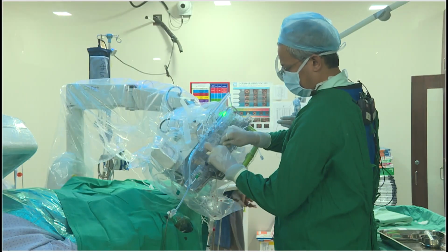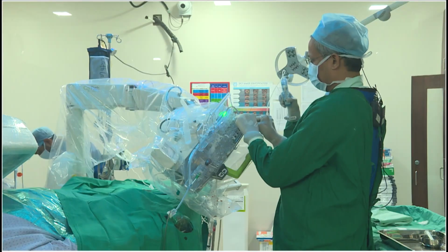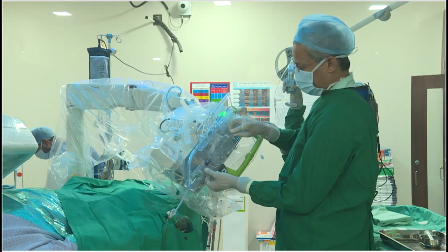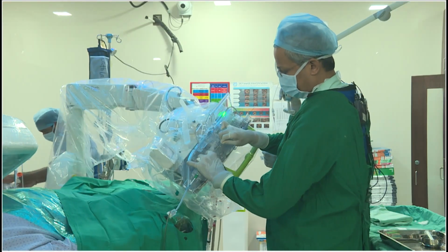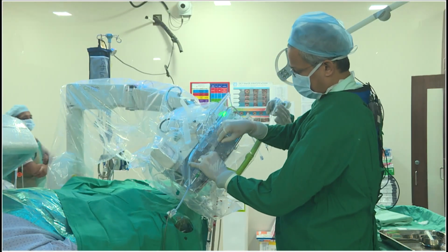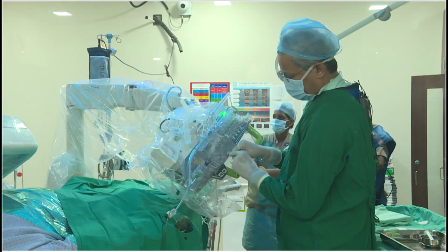So there is a holding knob over here, so that will allow us to hold the guide wire. Now we have the support of a guide wire that is held by a knob over here, so we can directly push the balloon into the co-pilot, right? So we are pushing the balloon in the co-pilot, loading over the guide wire. The cassette is holding the wire over here. Now the balloon is on. There is a slot over here for the balloon.